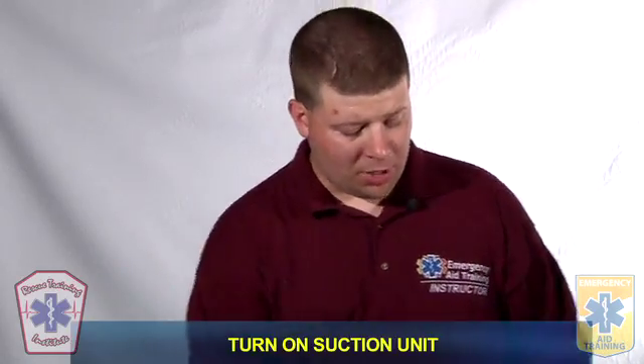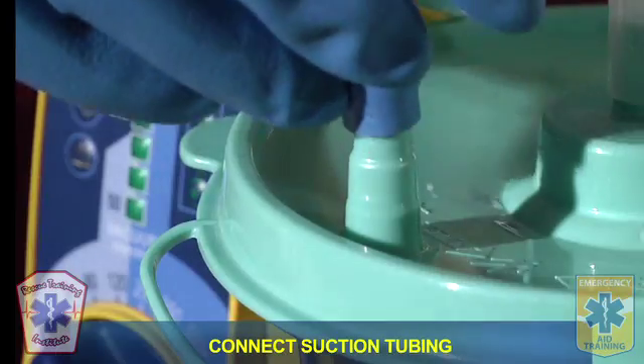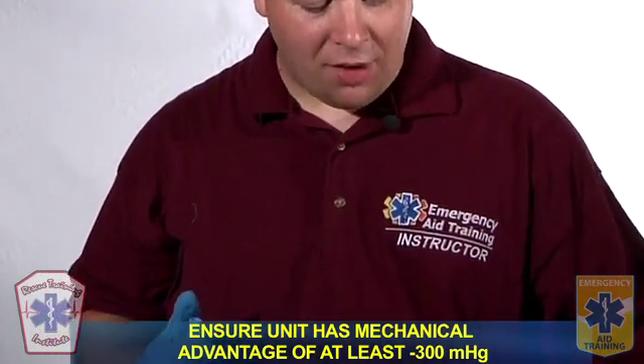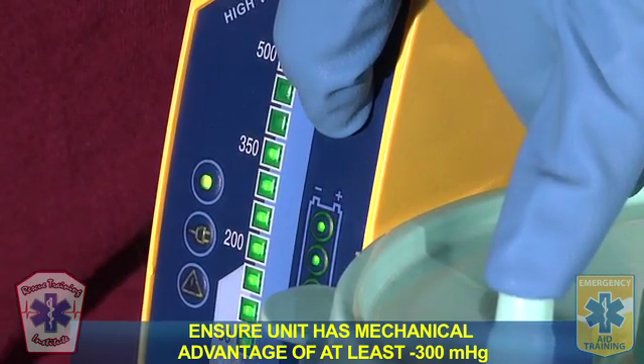Please demonstrate how you would suction your patient's airway. I'm going to turn on my suction unit and connect the suction tubing. I'm going to check my device to make sure it has a mechanical advantage of at least negative 300 millimeters of mercury, which it does.